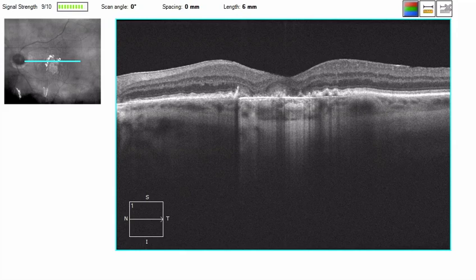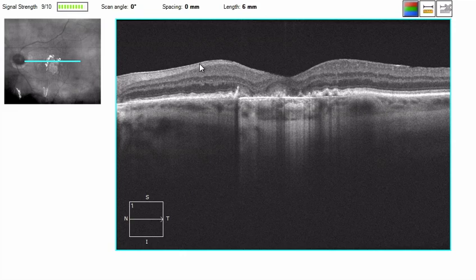This is an OCT from a 70-year-old gentleman. We know this is a left eye because of the nerve fiber layer always being on the nasal side of the retina.